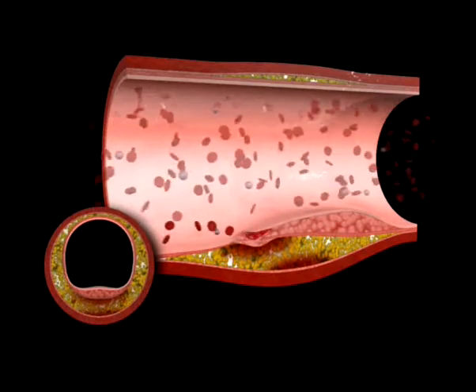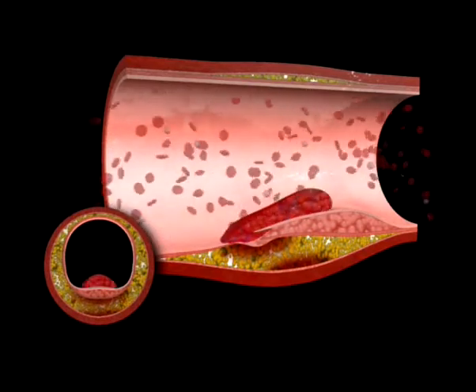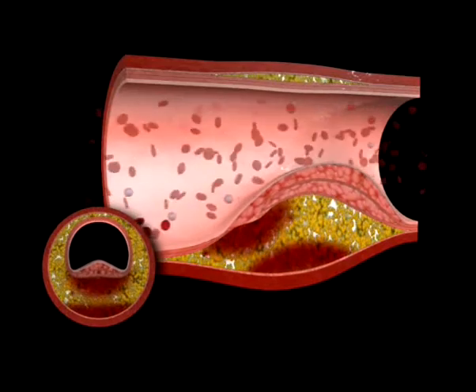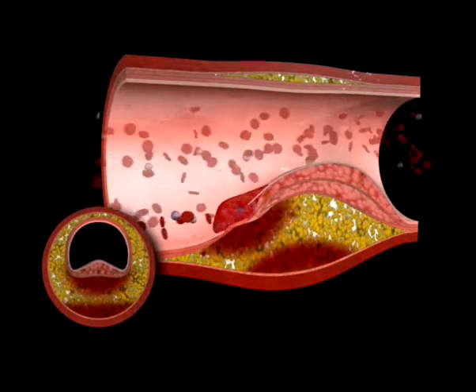Atherosclerotic disease progresses faster in some patients than others. In many cases, disease progression takes place through the repetition of plaque rupture, followed by vessel healing. A common treatment for these severe blockages is to place a stent, a tiny mesh tube designed to hold open the narrowed vessel and restore blood flow.